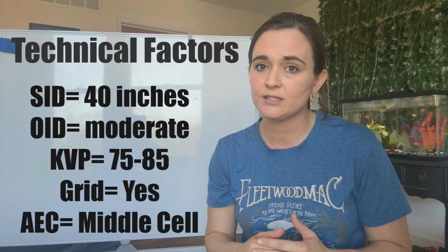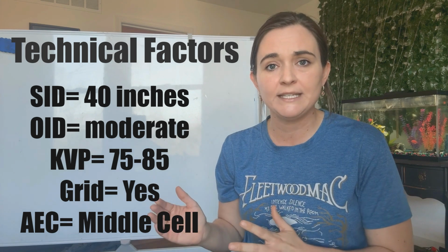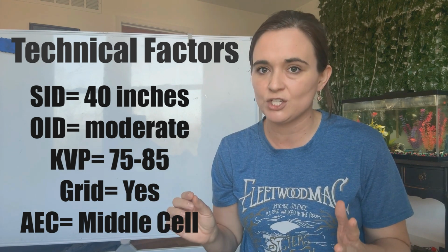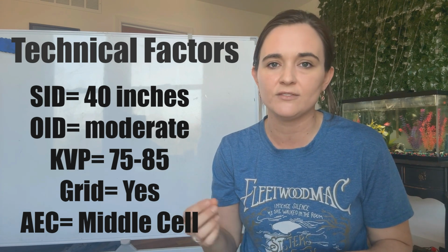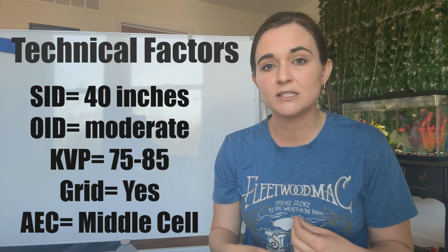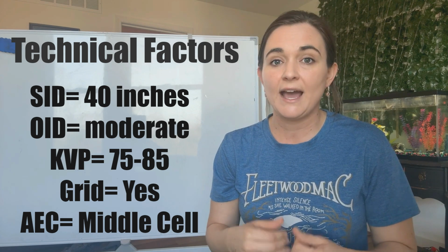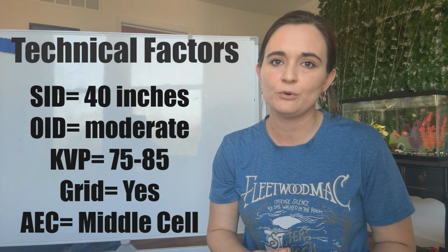We keep our SID again at 40 inches. But since she's no longer right against the board, our OID increases, which means we may see some magnification. To compensate, increase your kVp to 75 to 85. You may want to possibly raise your mAs as well. Always use a grid. Ask for expiration and remind her gently she may be uncomfortable.